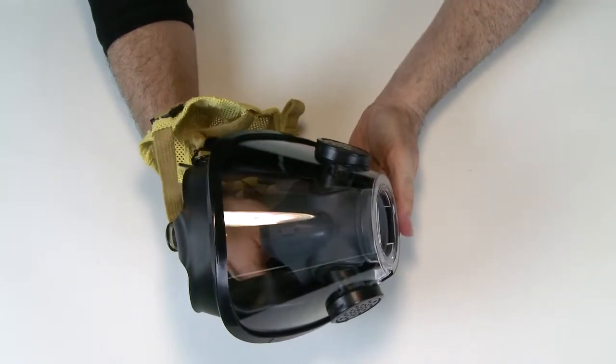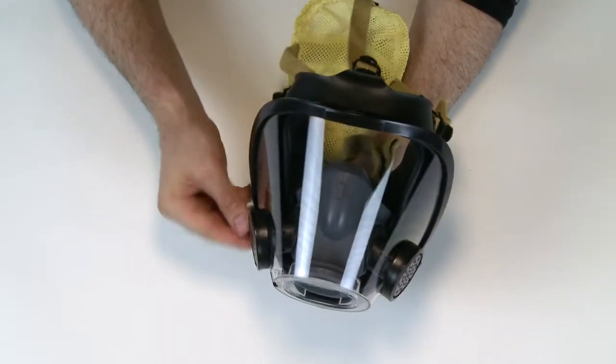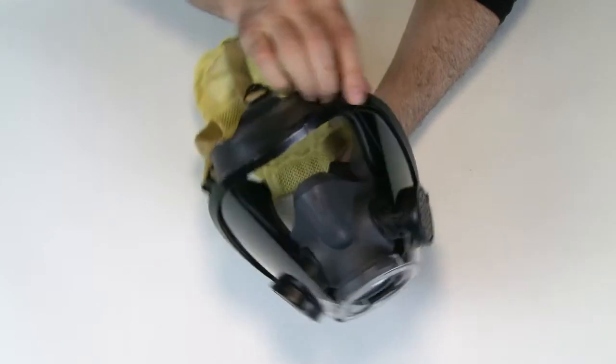Inspect the lens frame or bezel for damage, cracks, or distortion. Ensure all lens frame retainers or bezel screws are present and installed correctly.